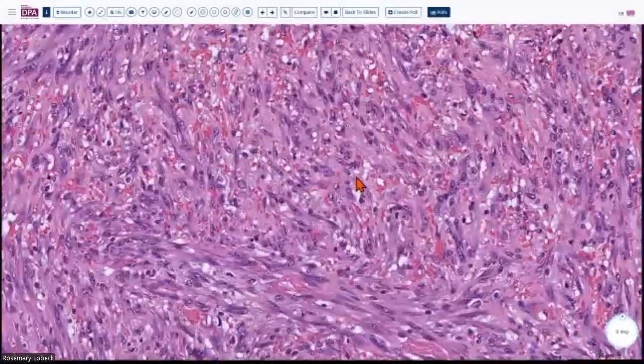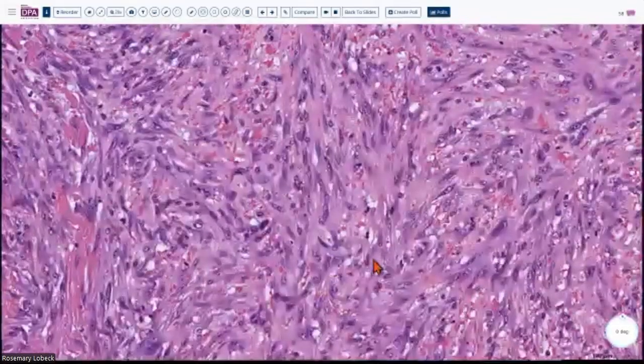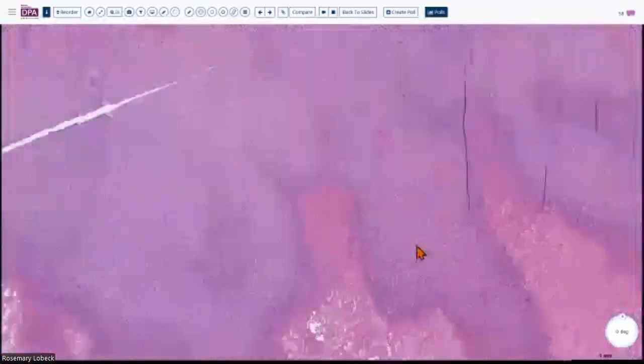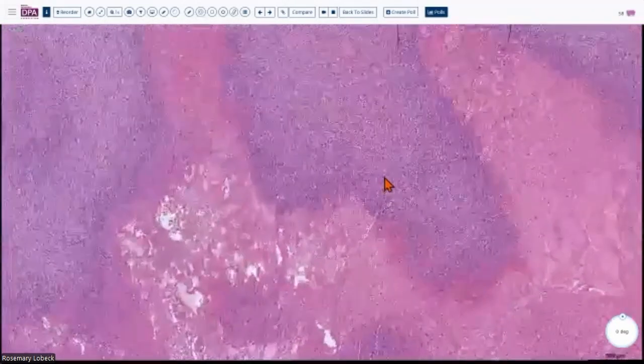So when I first look at this, I'm like, it's a spindle cell angiosarcoma. And when you do ERG, maybe inadvertently, you will see that ERG is positive all over because you have so many blood vessels in here. And anywhere you look, you can easily identify mitotic figures in this particular case. So this pitfall is huge, but when you pull back, you know that whole picture, the testicular torsion, and you have this huge hematoma and this proliferation. So that's going to be a myofibroblastic proliferation.